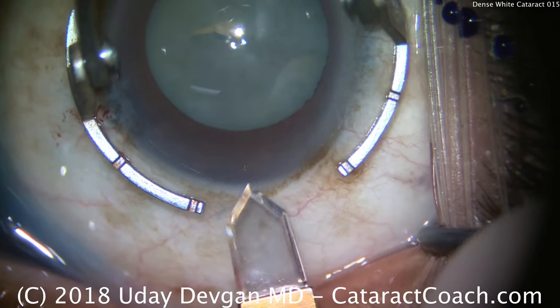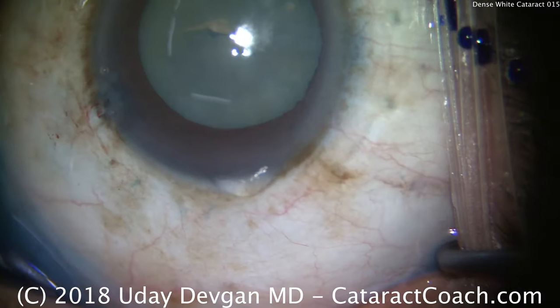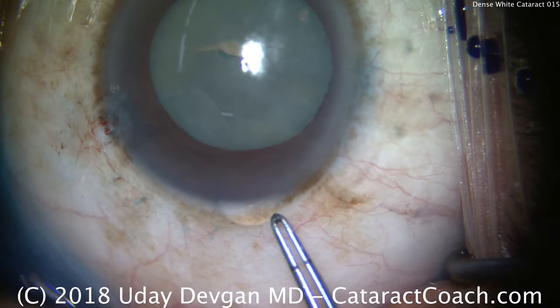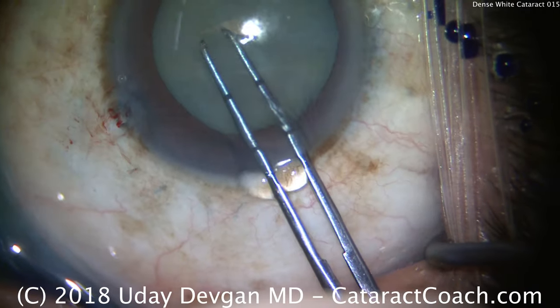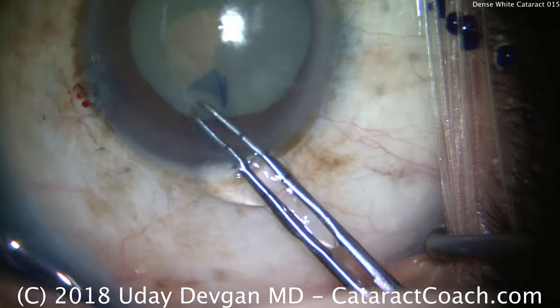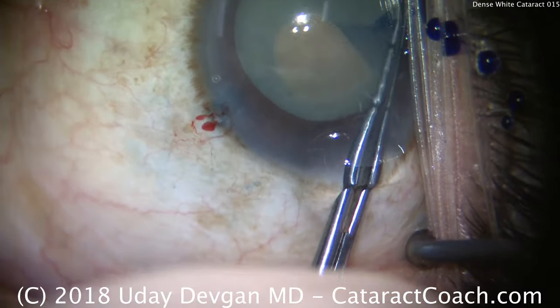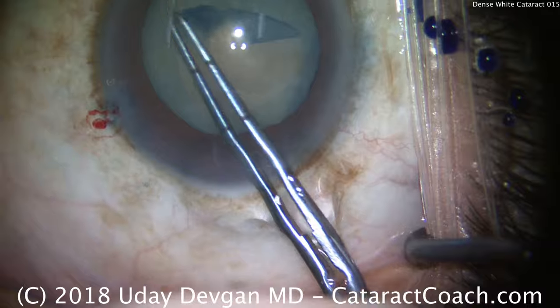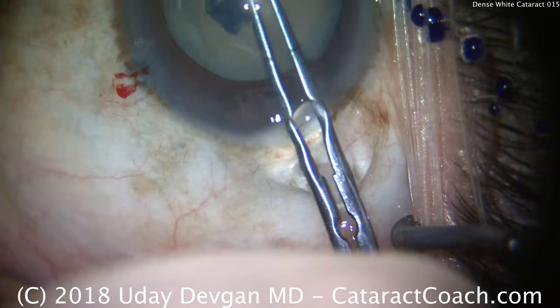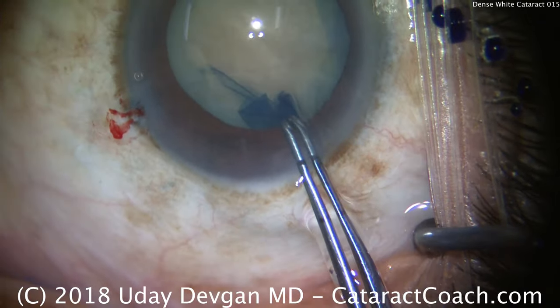So now let's go ahead and continue with the normal surgery. Main incision being made with a diamond keratome. If this was an intumescent cataract, we may have expressed some fluid out of it. We'll start our rhexis here, and you'll notice there's not going to be any fluid or milk coming out of the lens. So this is the nature of these yellowish or slightly brown-tinted cataracts — yes, they're white cataracts, but it's mostly nuclear density, and very little of it is liquefied cortex. So there's our rhexis.